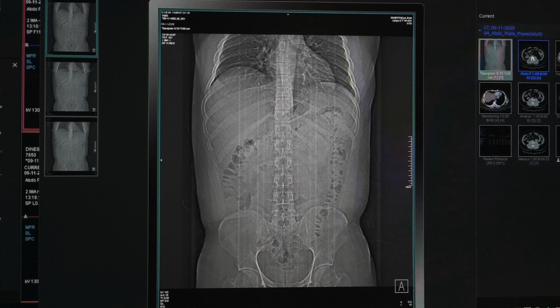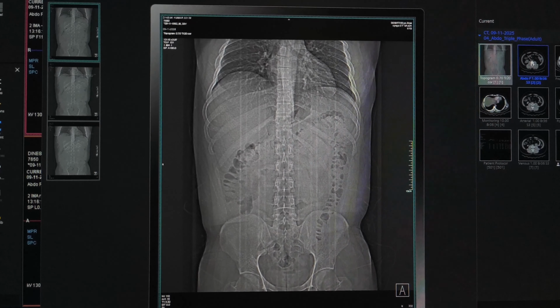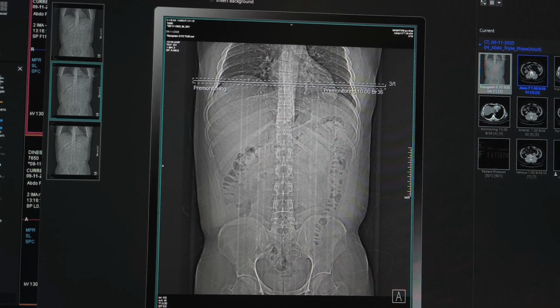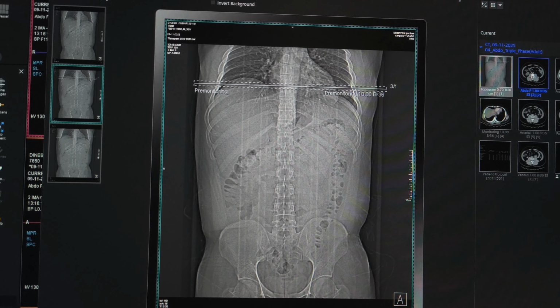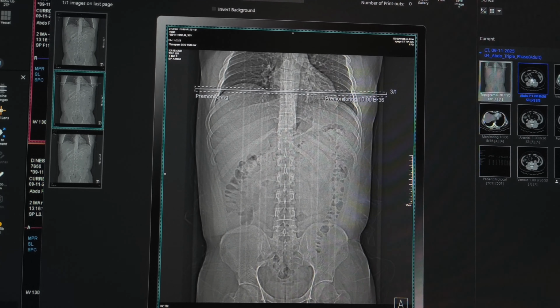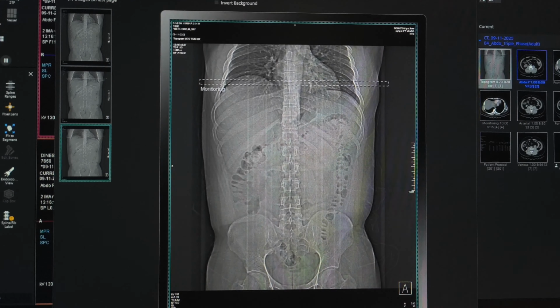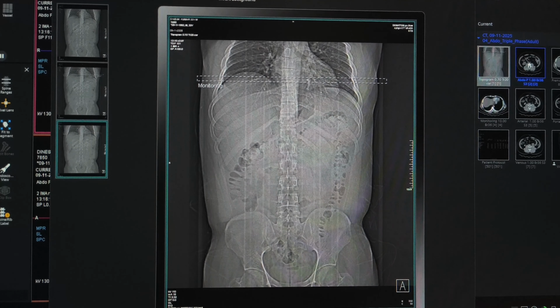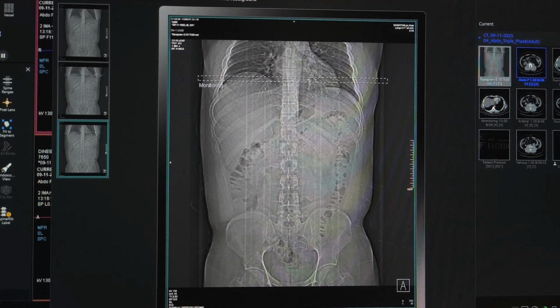Why do we take a topogram? To plan the scan area, to select start and end points, to position the patient correctly, to confirm which organs need to be covered. It is almost like taking a photo before starting the real scan.